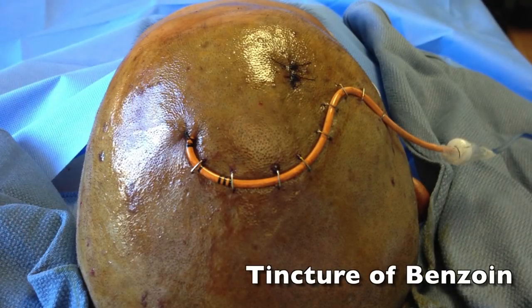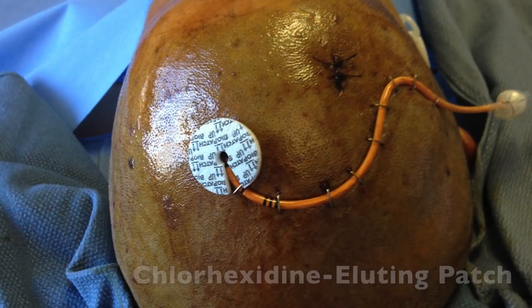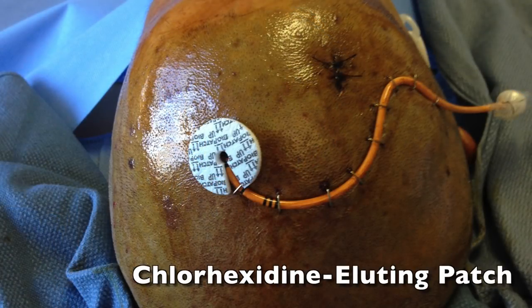The entire area is liberally painted with tincture of benzoin. A chlorhexidine-eluting patch is placed over the exit site, but not tucked under the catheter.